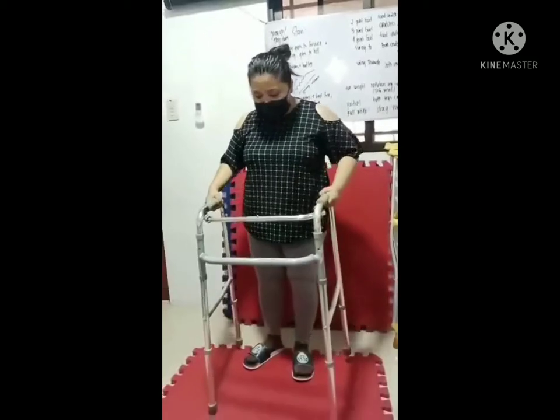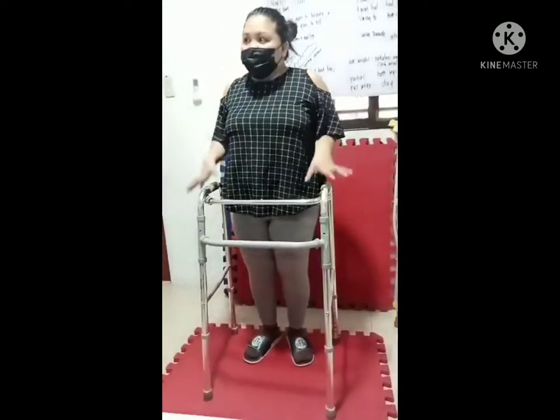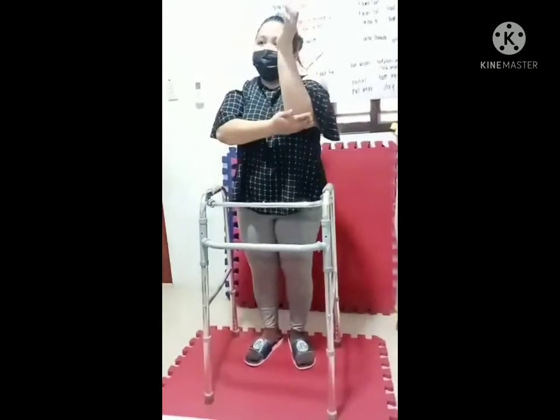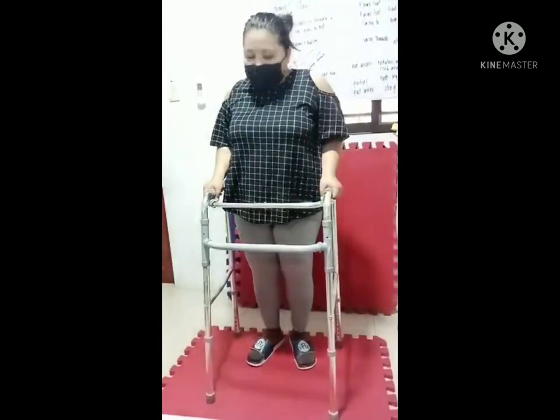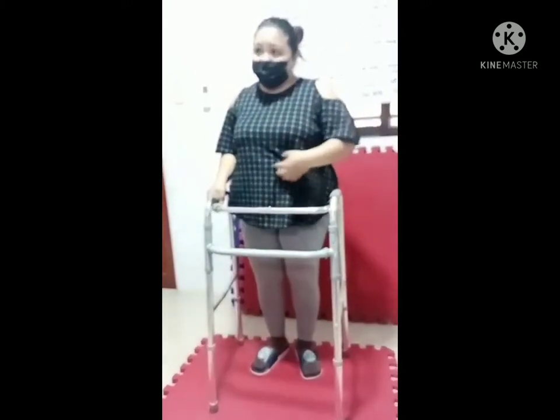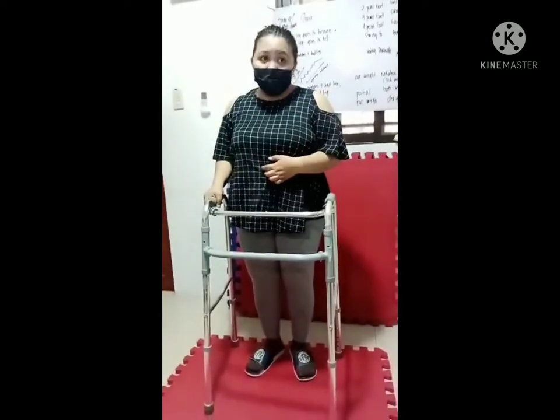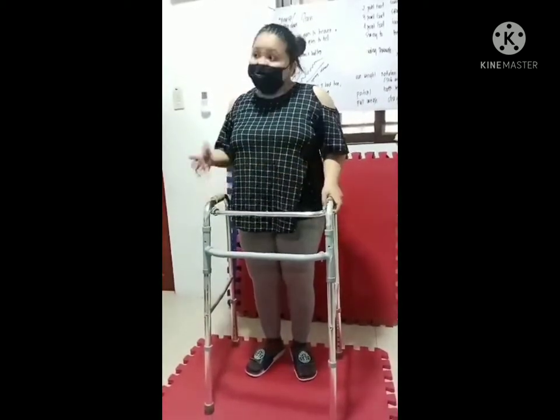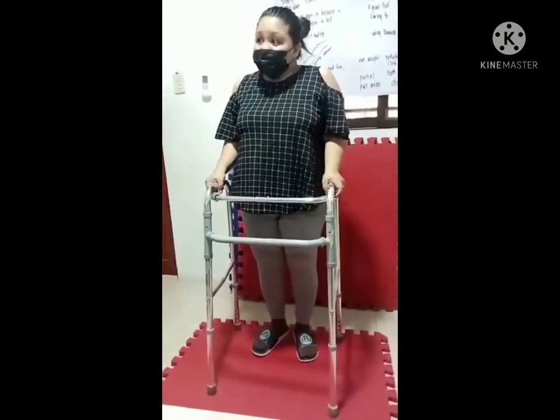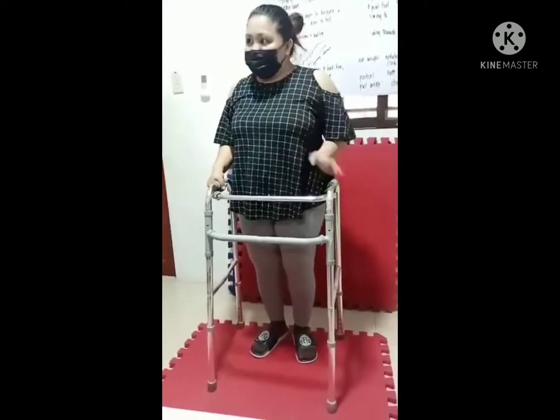Make sure that the patient is centered with feet at 45 degrees. The weight is focused on the handle, and the elbow should be at least 30 to 45 degrees. The patient should wear a gait belt. If there's no gait belt, we use a draw sheet to serve as the gait belt. The patient should also perform the two-point gait and the three-point gait with the walker.